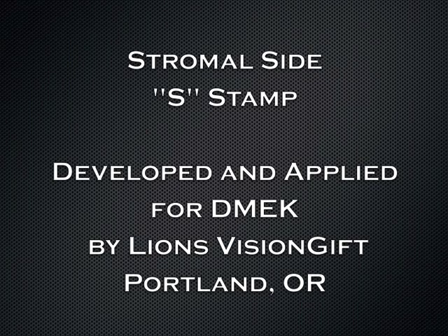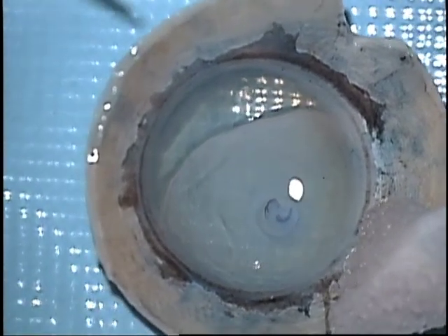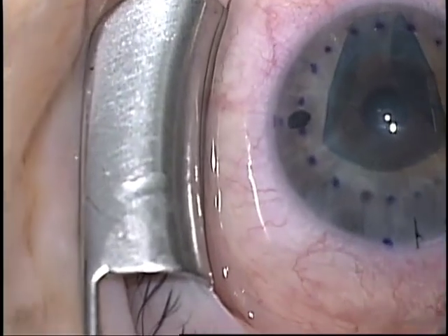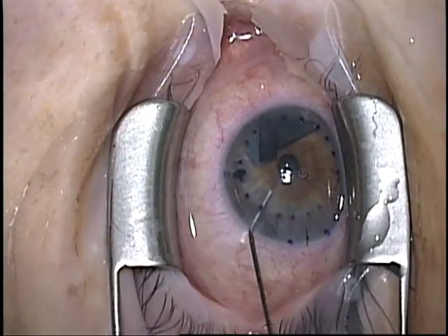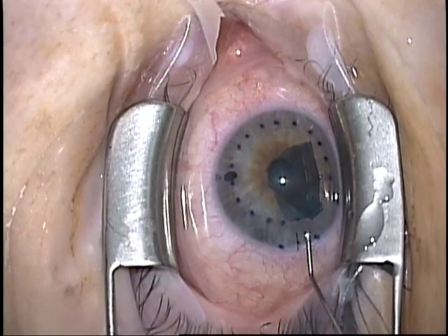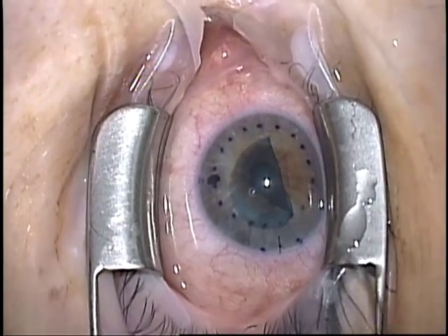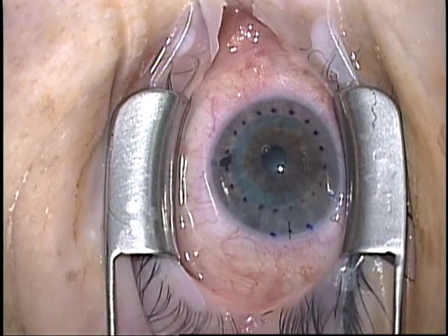It's situations like these that drove the development of the stromal-sided S-stamp for DMEK surgery. This graft is nicely prepared by Lion's Vision Gift in Portland, Oregon, with a dry ink technique applying the S-stamp to the stromal surface of the graft. Here I am using the technique clinically — I've injected this graft and I'm opening it, and I can see a backwards S, so I know the graft is upside down. I don't have to use any other techniques to confirm that. So I reorient the graft, sweep it into position, and look to see if I have a right-side-up S-stamp. Vital dye staining has shown that the S-stamp technique as applied by Lion's Vision Gift causes very minimal cell damage. I can now see a right-side-up S-stamp, confirming I can proceed safely with the case.